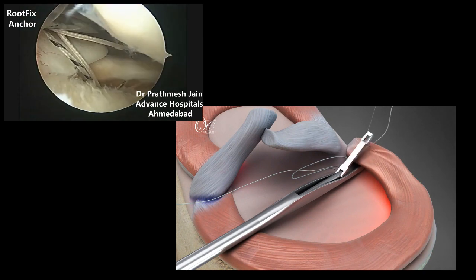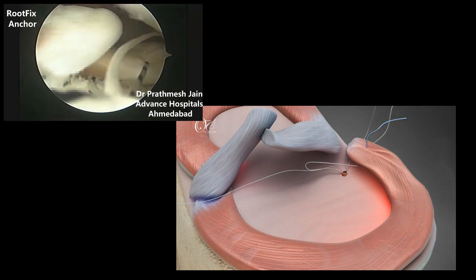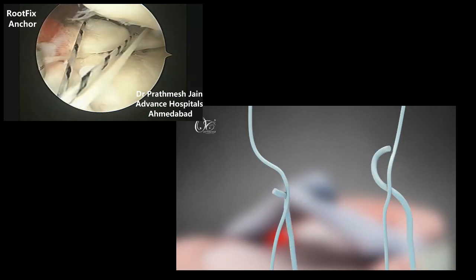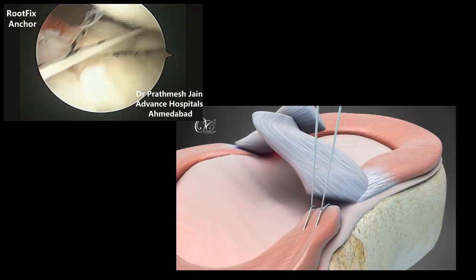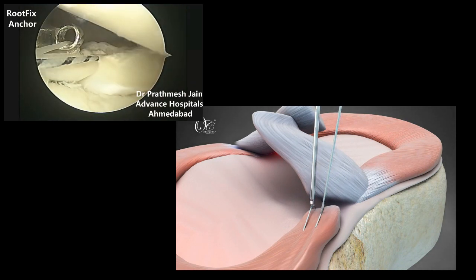The same step is repeated with the second fiber. The reduction is then attempted by reducing the root to the native position. Both fibers are tied over the meniscus, and the final knots are locked using the knot pusher. The medial meniscus root is then fastened to its tibial bed.